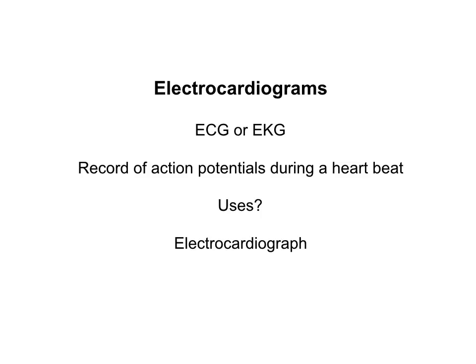Now, the tool that is used to create this electrocardiogram is an electrocardiograph. And there are many different kinds, some giving more information, some giving less information. We're going to take a look at an electrocardiogram and sort of hit the basics, something that if you're heading into our nursing program, you've got information to support further study and use.